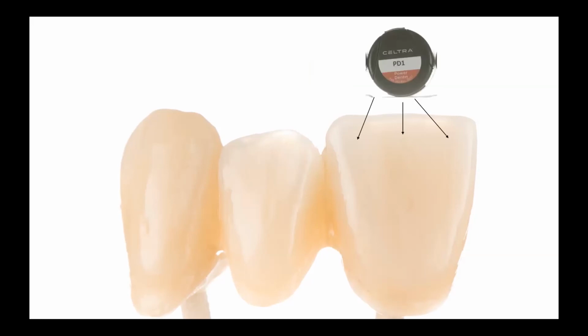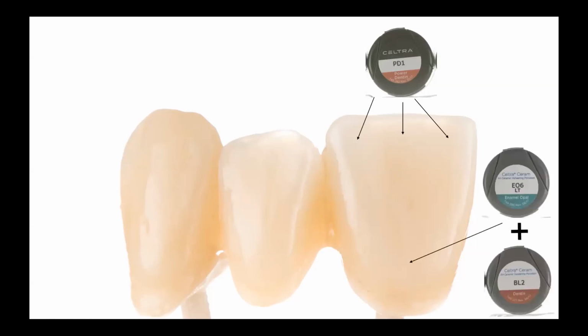We kept on working with the power dentin. This is a rather bright porcelain with increased chromaticity, and this porcelain can imitate the structure of mamelons very effectively. And to increase the reflection of the light in the middle part of the central, a mixture of bleach and whitish opal enamel was used.